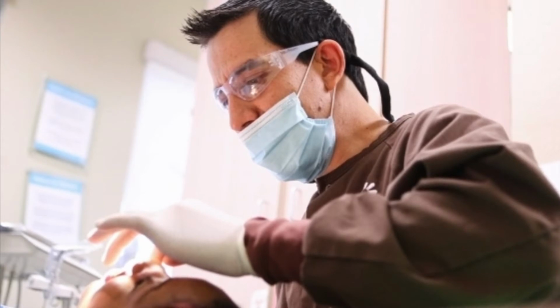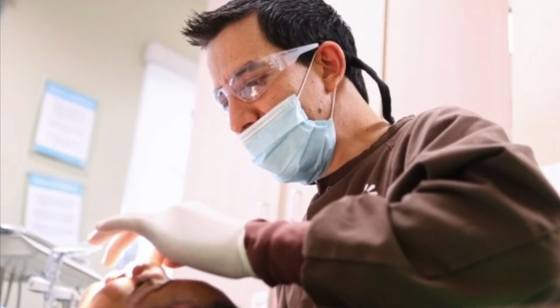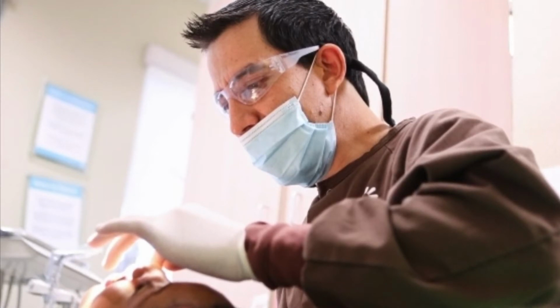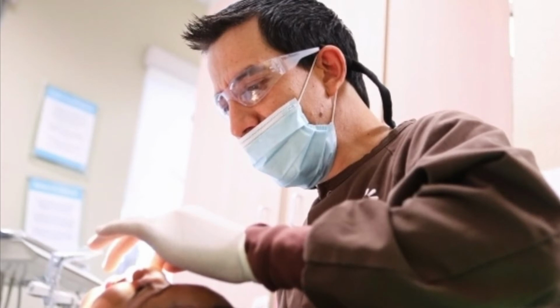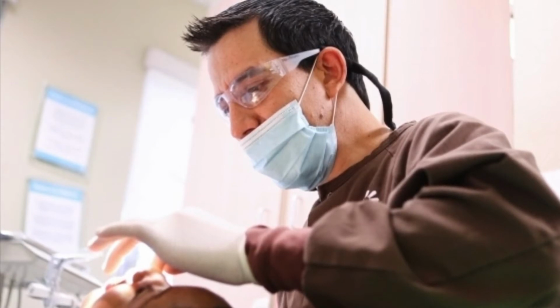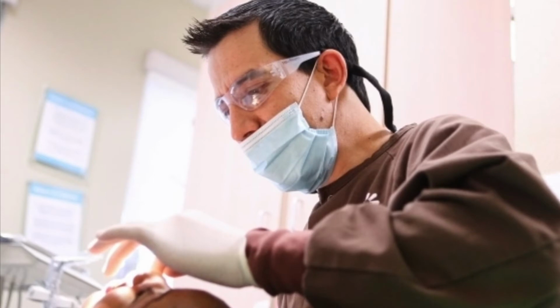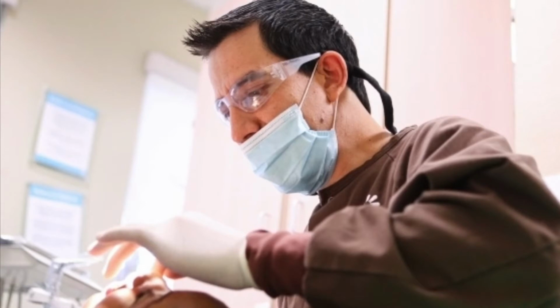hard tissue alteration of the tooth. Again, I will repeat it for you to understand it. Aid in the diagnosis and localization of hard tissue alteration of the tooth, sclerosis and resorption, and periradicular structures. And this is the endodontic radiograph importance.